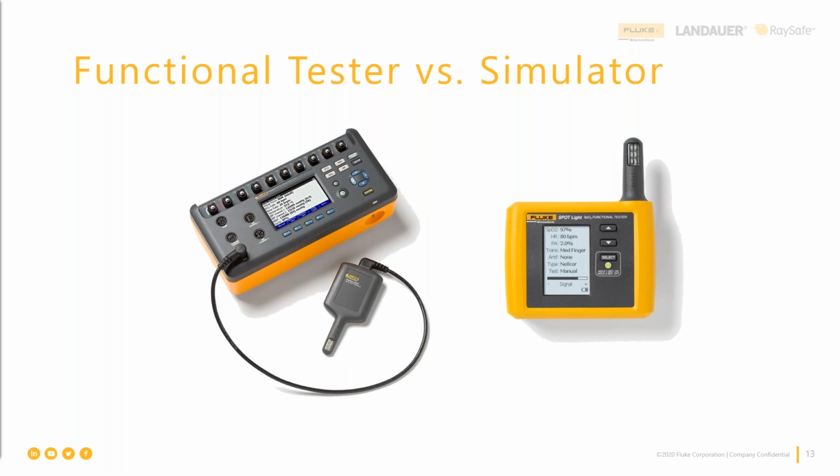It is an important point to note that these testers are not true simulators, like the ProSim8 itself. The FDA has in fact declared that they should not be called simulators. A finger simulator would have to actually have the light shine clear through it and actually contain a pulsing medium that would mimic the actual hemoglobin being oxygenated at various levels. And you can imagine the complexity behind that. So Fluke testers pretend in a different way to be a human finger. And it's done in a way that it can be programmed for a wide range of variables in order for you guys to be able to do the most comprehensive testing available.